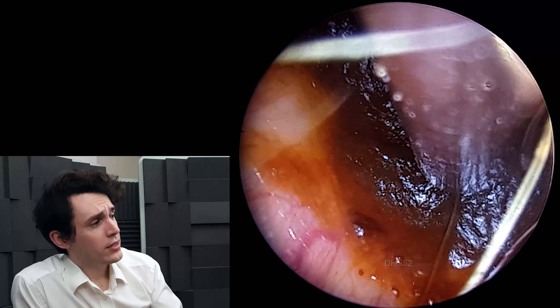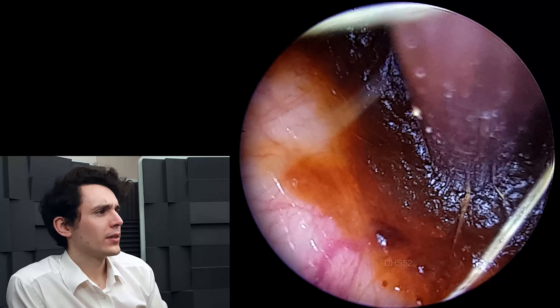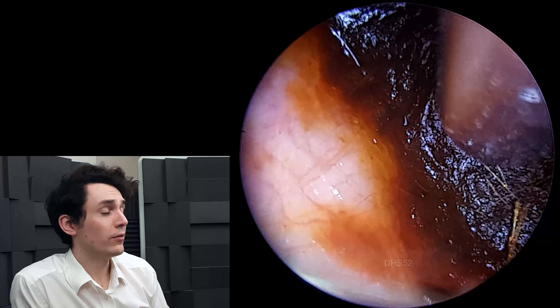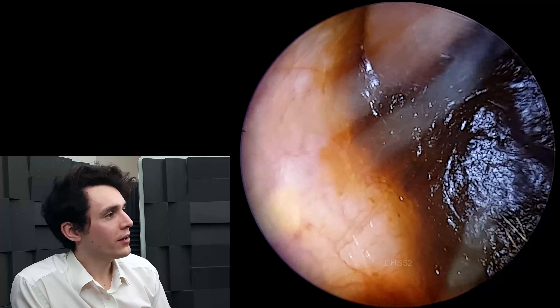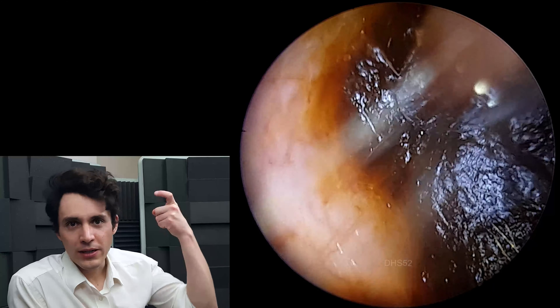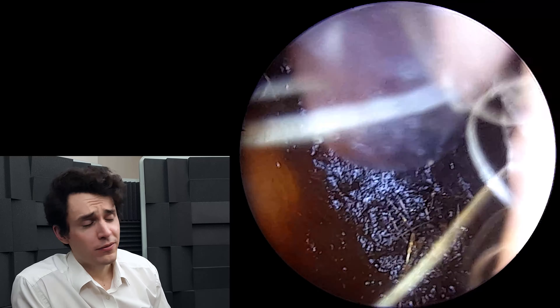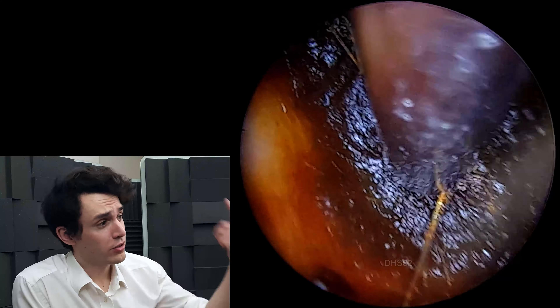So the first half of this video, you're going to see me working through this very thick, dry, sticky wax, which is unfortunately the worst of consistencies. It's not quite hard enough such that you can drag it out all in one big boulder with a hook or a suction. It's not quite soft enough to pull apart in chunks or draw straight through the suction probe.